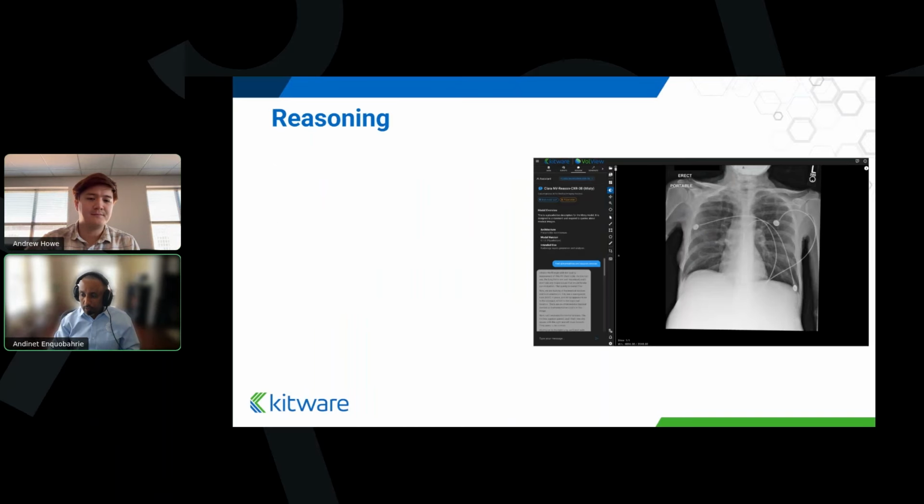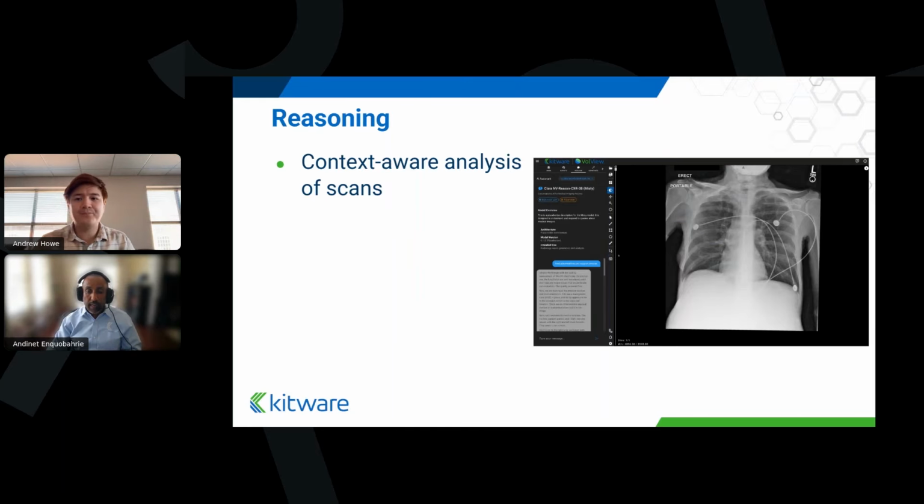And then just quickly to wrap up the use cases, the last one is something that's also becoming very critical, this aspect of reasoning, right? Can you provide the AI models with the imaging data plus some additional textual context information?